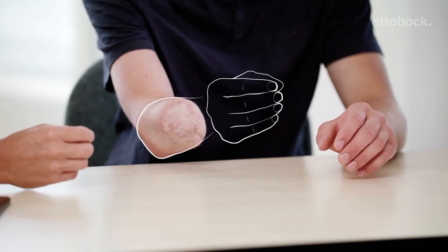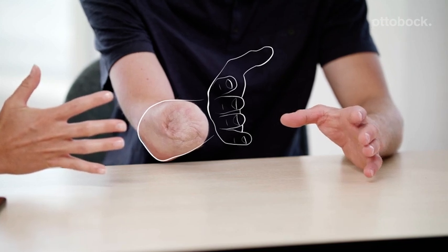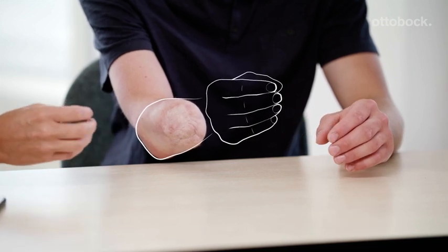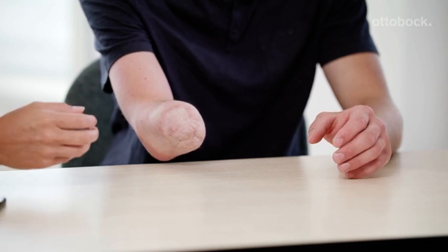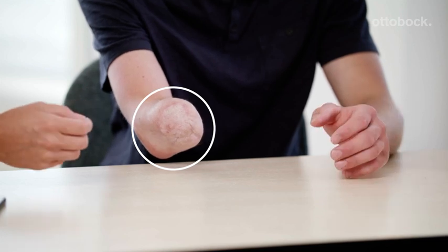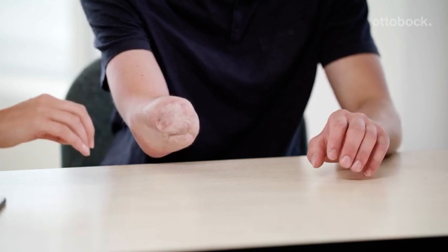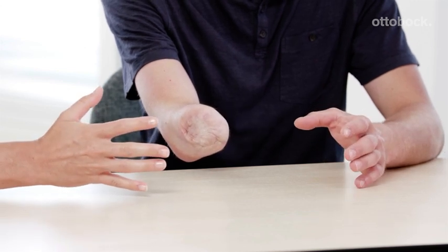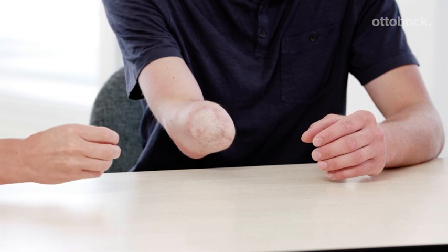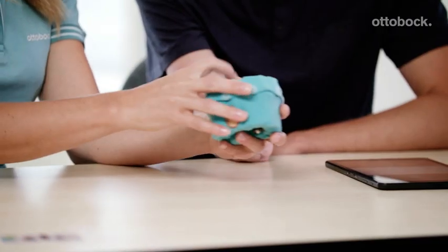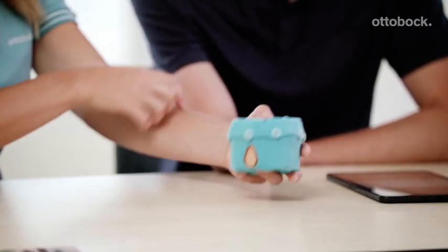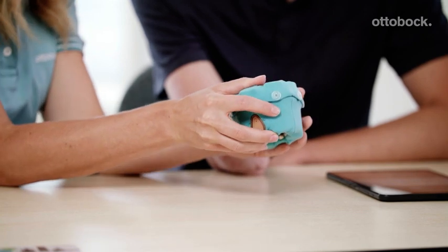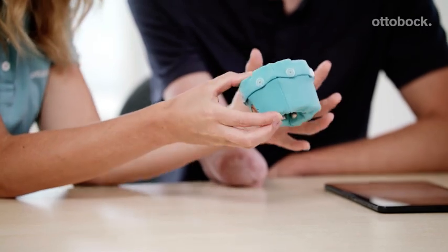Most amputees can still feel and move their phantom hand. These movements are called phantom hand movements. Phantom hand movements are associated with the muscle contractions of the residual limb, which are recognized by Myo Plus as movement patterns. Greater dexterity of the muscles and better visualization of the phantom hand lead to more movement patterns. As a result, enhanced prosthetic control is achieved. Individual movement patterns are therefore necessary for Myo Plus control. The Myo Cuff is used prior to the prosthetic fitting to evaluate how many movement patterns are possible.